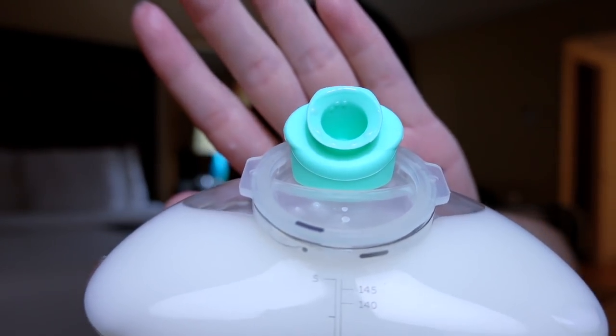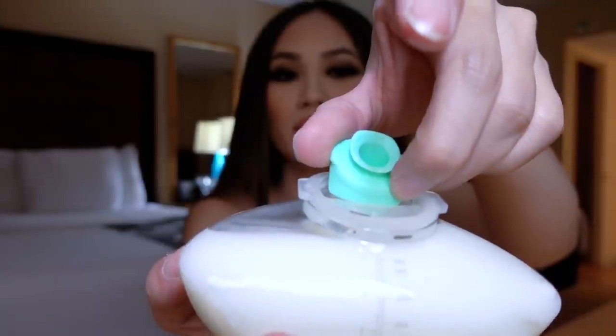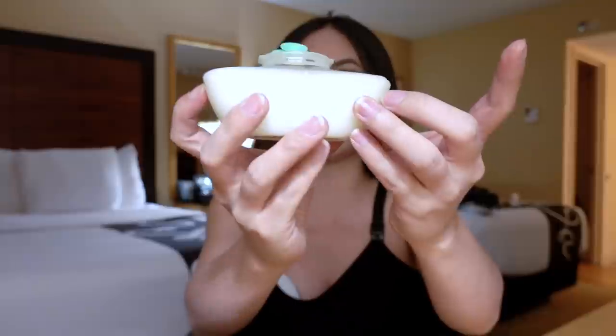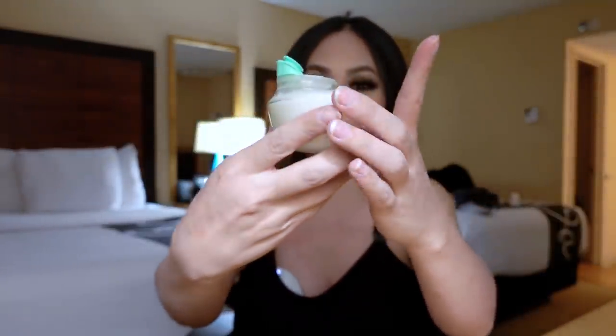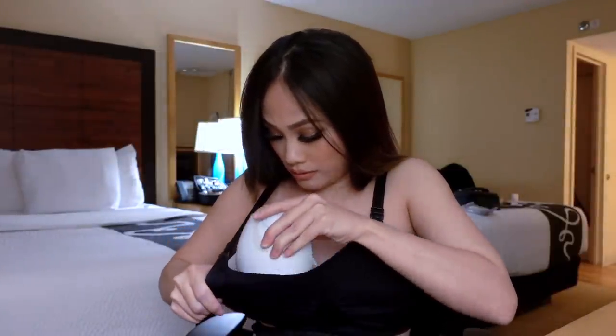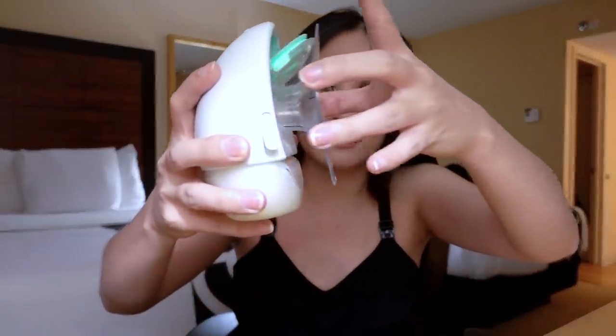I don't know if you can see that, but there it is — it'll leak through the sides here and there. So you've got to get a good position with this pump. There you have it — the Elvie pump, I just finished. I think I have to do a second one because my boobs are super engorged. This is my other boob — leakage. Sometimes I get lucky and sometimes I don't. You just have to find the right position, and maybe sometimes you find the right position and it still leaks. But this is how you take it out.